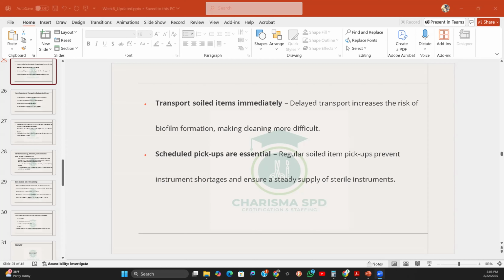So, Professor John, let me add this just to put more light on what you are saying. I overheard someone saying you cannot use the cart to transport instruments back to the OR. The reason you can do that is that, remember, the case cart is just a container that you carry the sterile instruments in. It doesn't touch the patient. It's just like the box where you put the tray to the OR. It doesn't mean that you can take it back in there contaminated. All you have to do is disinfect it.